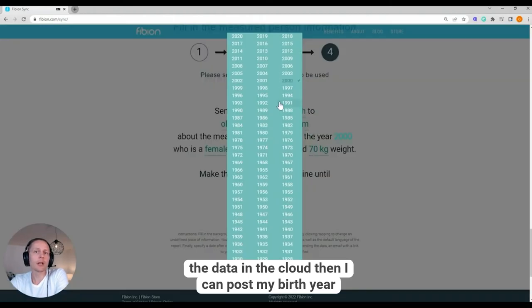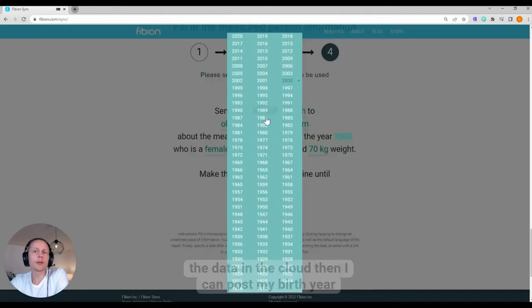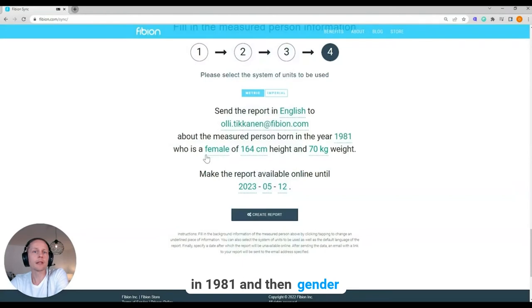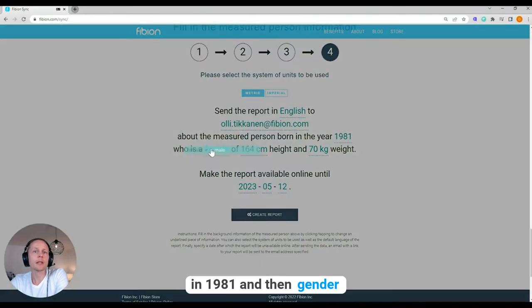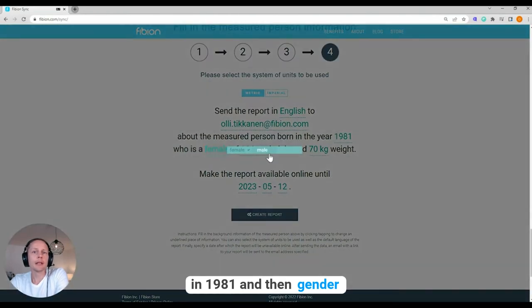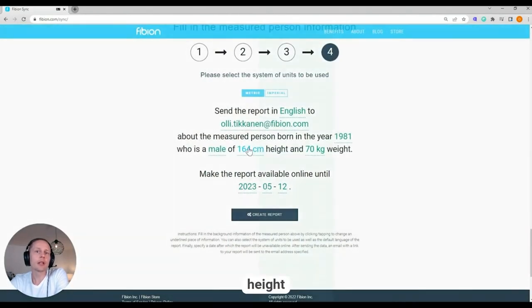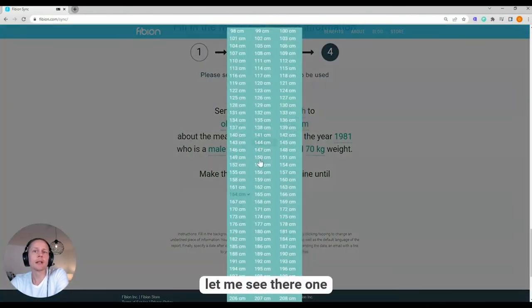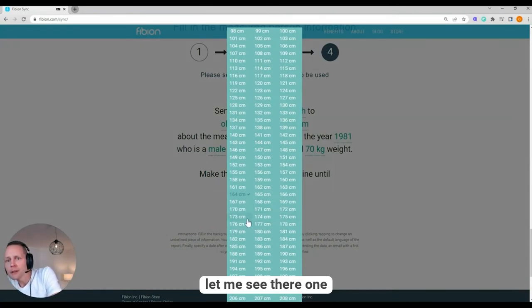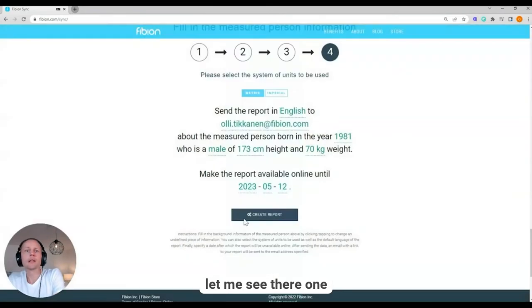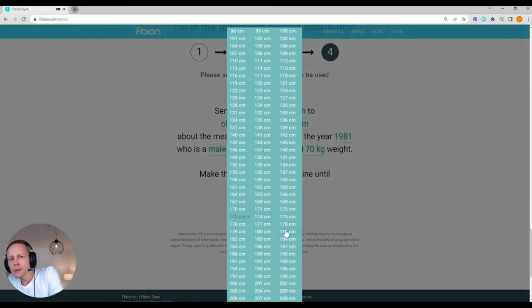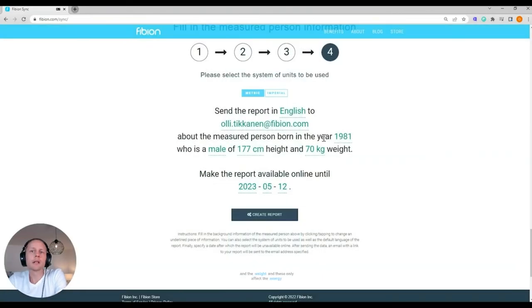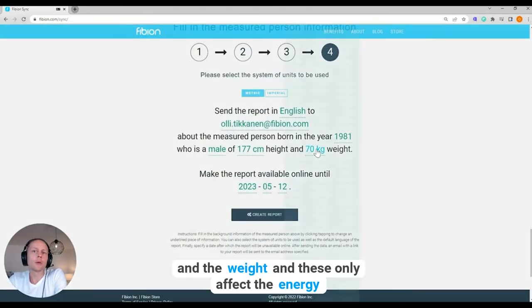Then I can put my birth year, 1981. And then gender, height. Let me see. I have it there. One, one.